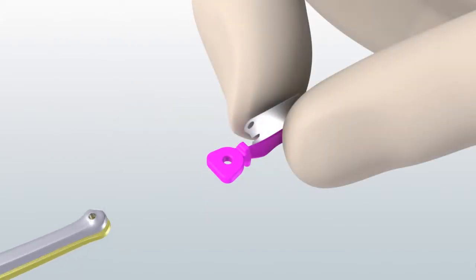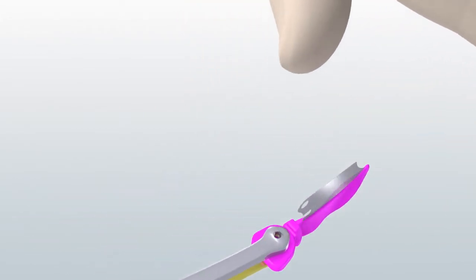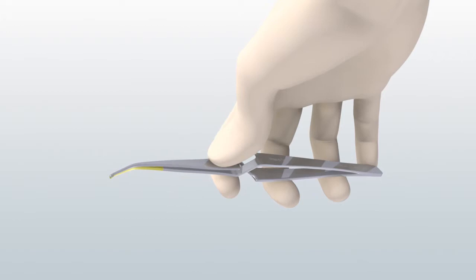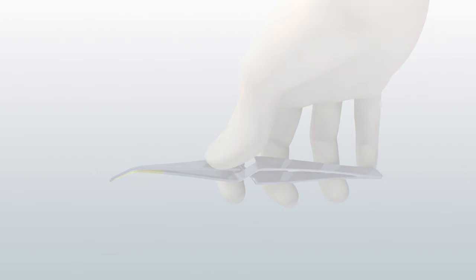Before cutting the cavity, pre-wedge using the appropriate sized wedge guard. Grip the wedge guard with Triodent pin tweezers. Press the pin tweezers at the back to open or release, and at the front to grip. In their passive mechanical position, the tweezers will hold wedges and matrices. To obtain a secure grip, apply firm pressure to the front as shown.